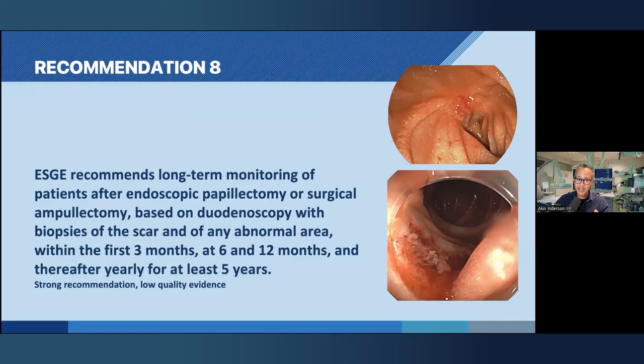Now, for the last recommendation, number 8, ESGE recommends long-term monitoring of patients after endoscopic papillectomy or surgical ampullectomy, based upon duodenoscopy with biopsies of the scar and of any abnormal areas within the first 3 months, 6 months, 12 months, and after the first year, you can do it yearly for at least 5 years. Everyone can do that, but you have to do it with either cap-assisted endoscopy or the side-viewing endoscope, so make yourself proficient at using a duodenoscope as well.